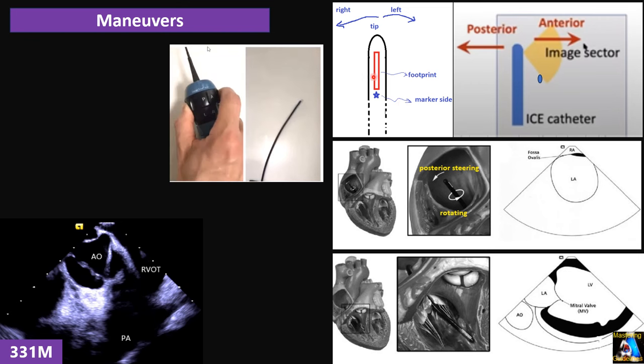In the left part of the video, an ablation catheter has been advanced into the right ventricle via a deflectable sheath. The catheter is placed parallel to the right ventricular free wall, and the ablation tip is placed in the ventricular aspect of the moderator band to help with catheter stability at the time of RF delivery. From this view, further clockwise rotation will show the inferior apical aspect of the left ventricle, and then the papillary muscle comes into view. In this case, an ablation catheter has been placed retrograde into the LV, and the tip placed at the inferior portion of the posteromedial papillary muscle.